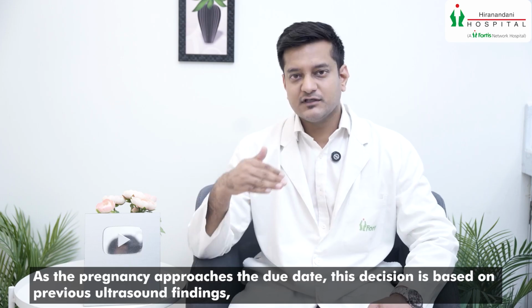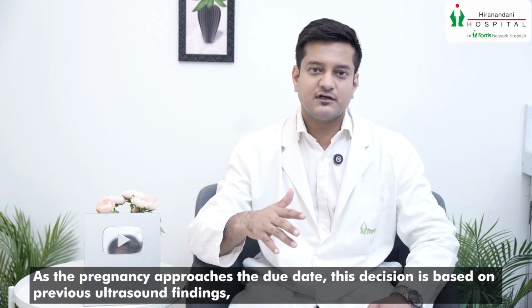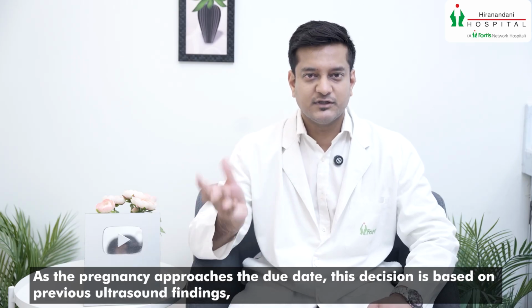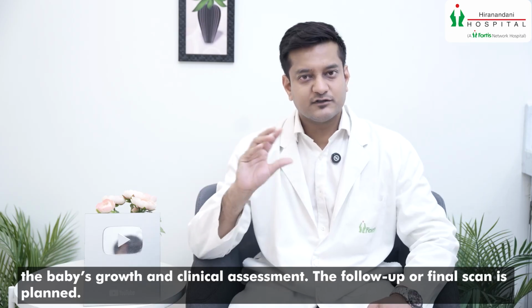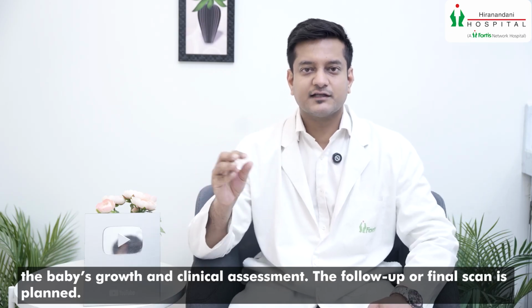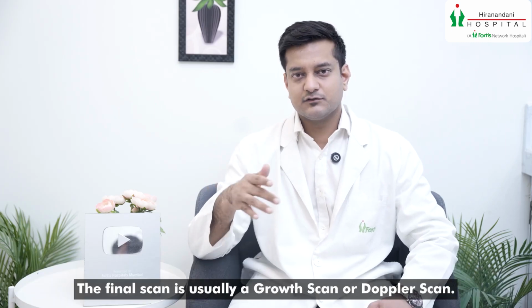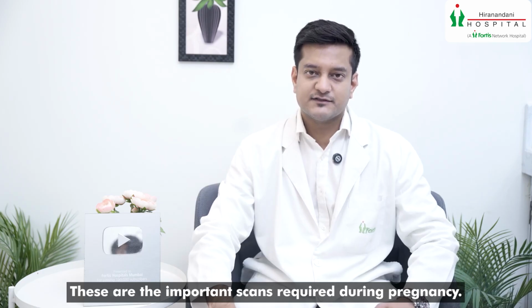Once the pregnancy comes near term, based on the previous ultrasound findings and the growth of the baby, and the clinical findings of the obstetrician and gynecologist, the follow-up scan or the final scan can be planned, which is again a growth scan or Doppler scan. So these are the important scans which are required in pregnancy.